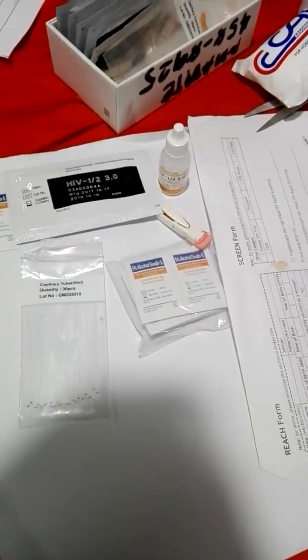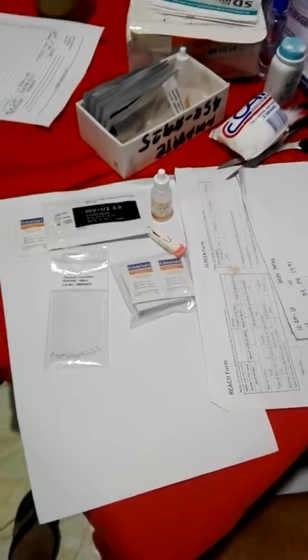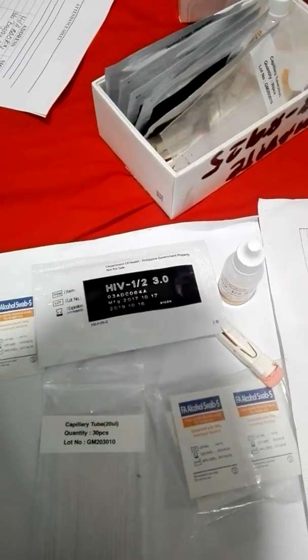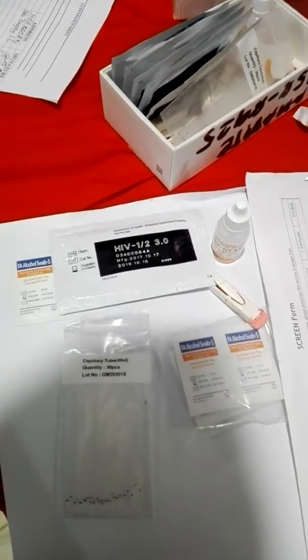So the following are the necessary apparatus the recipient needs to undergo. As you can see, that one is the capillary tube, which is responsible for getting the blood from the recipient. We also have the FA alcohol swab, which sanitizes the area where he needs to prick the patient. At the same time, this is the HIV 1/2 3.0 HIV test medical kit. So everything is there. We also have the lancet.